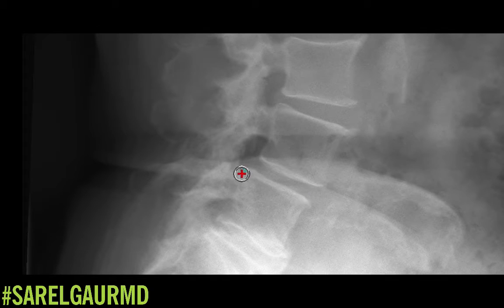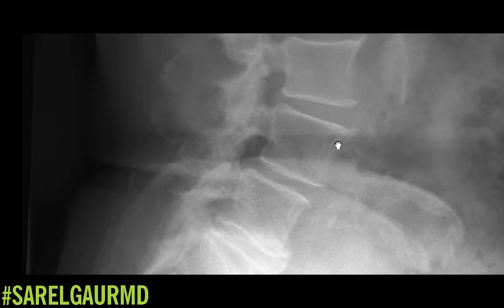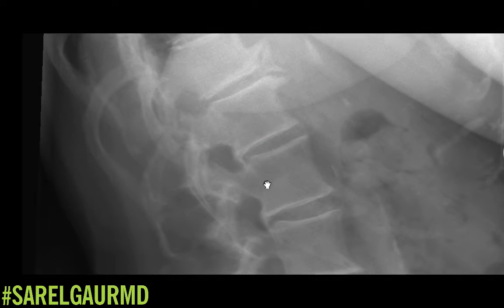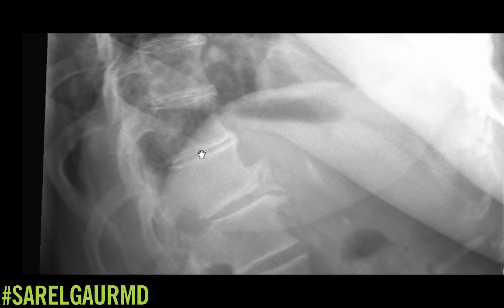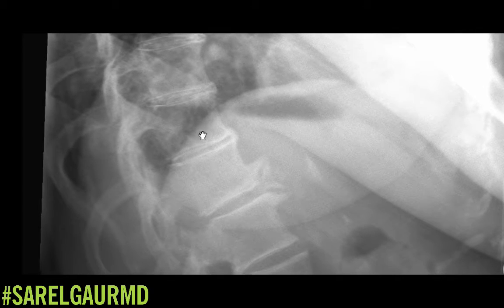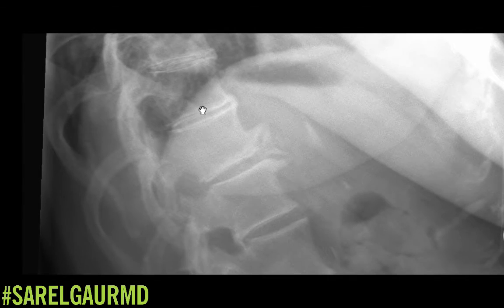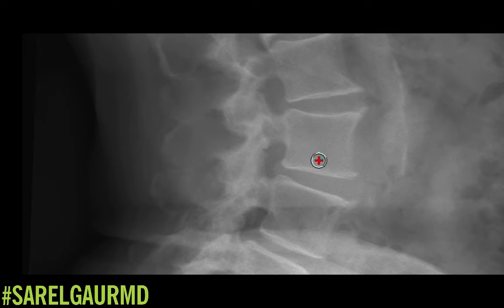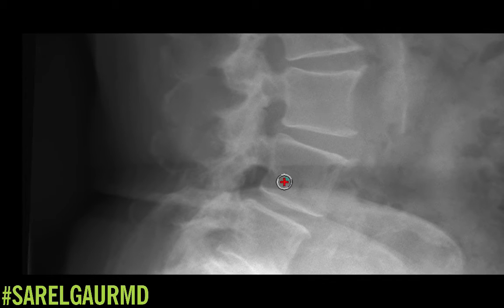Looking at each vertebral body now for height: L5, L4, L3, L2, L1 all look intact. I'm also checking the thoracic vertebral bodies — I don't want to miss a fracture of the thoracic spine. Lumbar vertebral bodies look good for height. I don't see focal osteolytic or osteoblastic lesions.